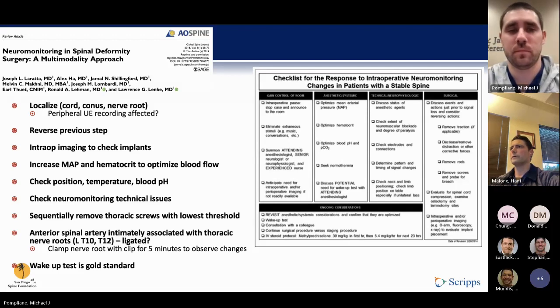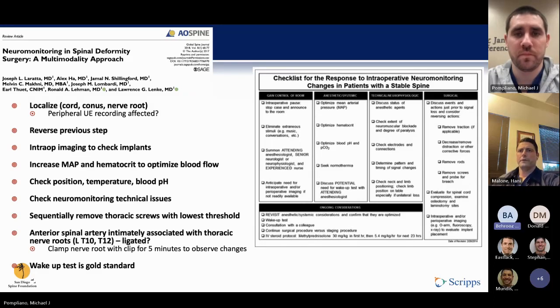Greg, are you doing video at the same time, for records, of what you're doing and its effect on neuromonitoring? Video of the surgical site? I wish. No, we're not. That'd be great. There were some records in the past. I think there were some studies that show that while you're doing it, at the same time you can correlate what happens in the surgical site with changes in neuromonitoring, and that also helps the person who's doing the neuromonitoring to see.